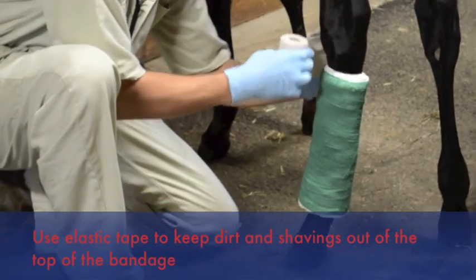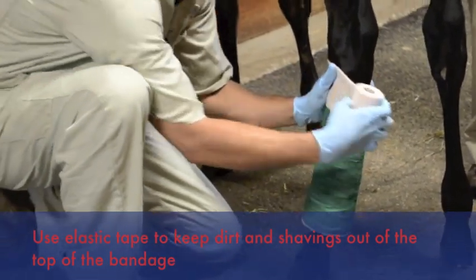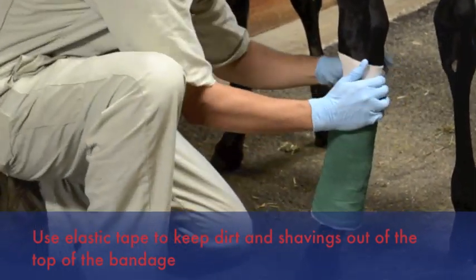We'll use a few loops of elastic on the top to help hold the bandage in place and keep debris from creeping down into your bandage.